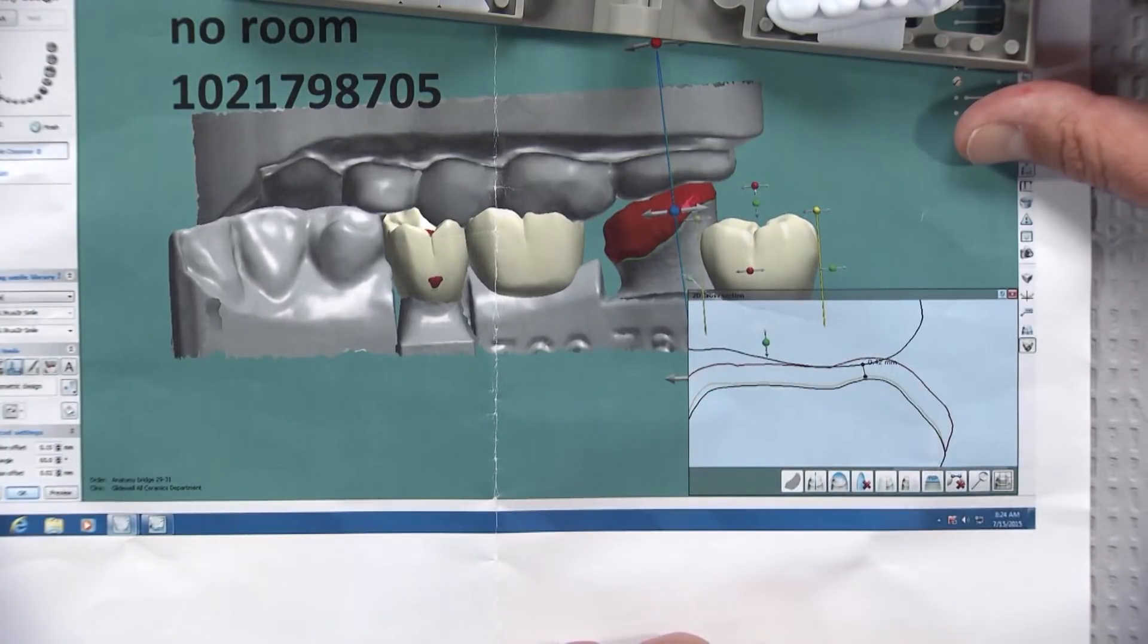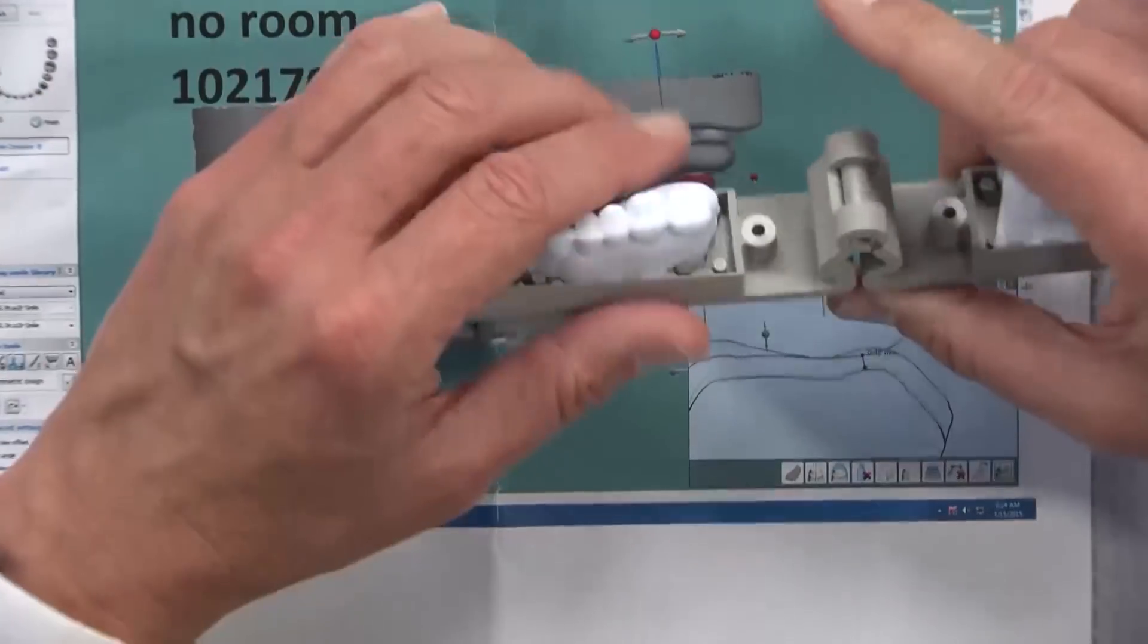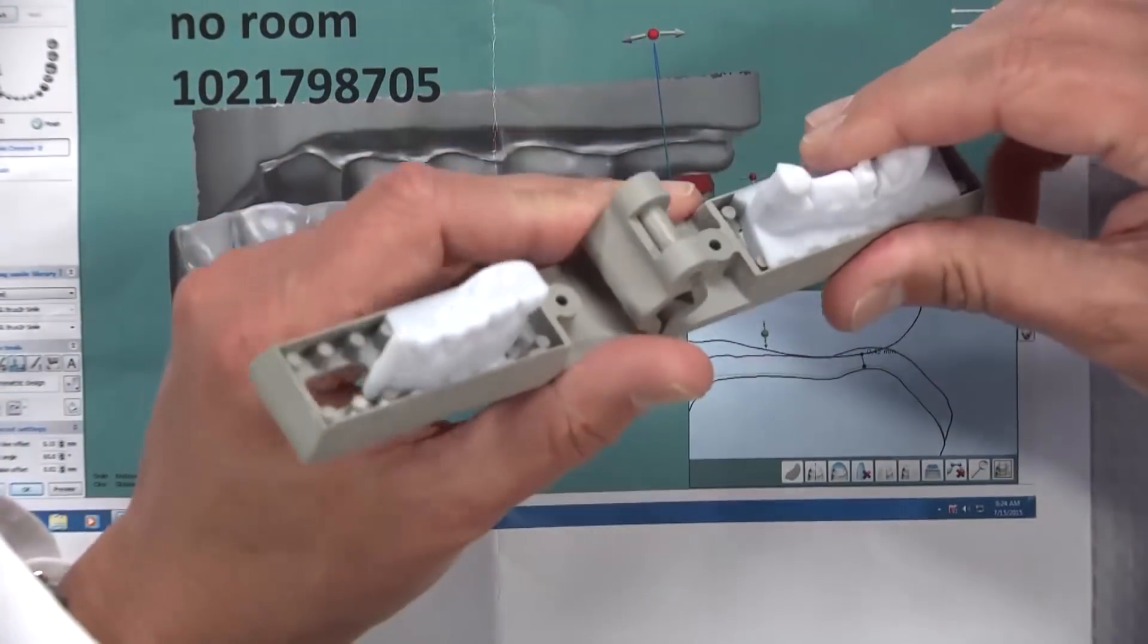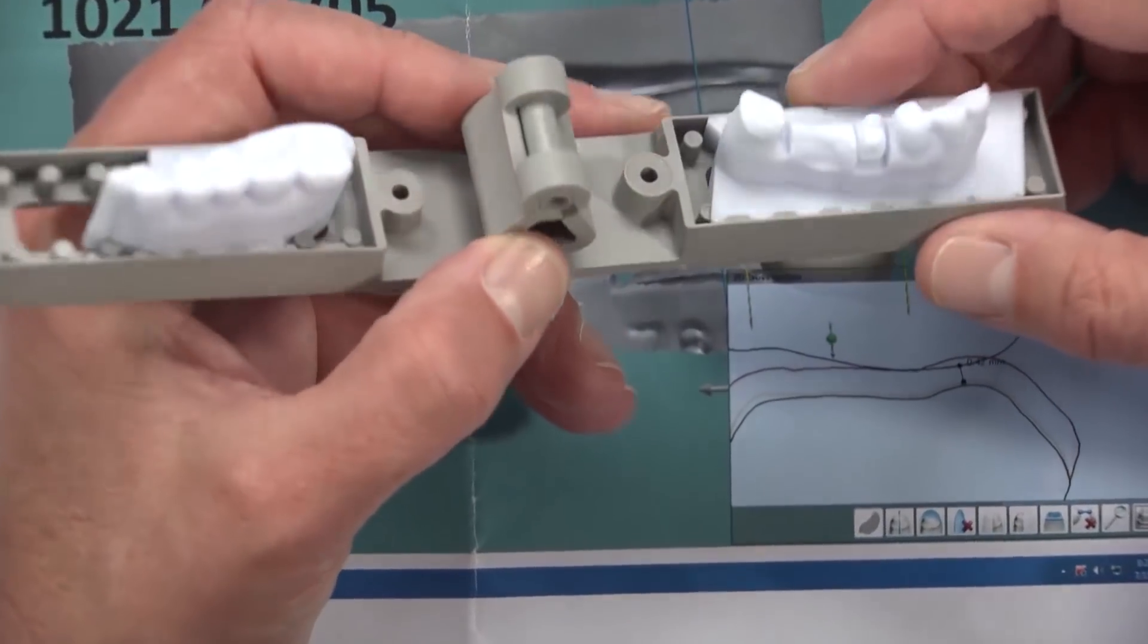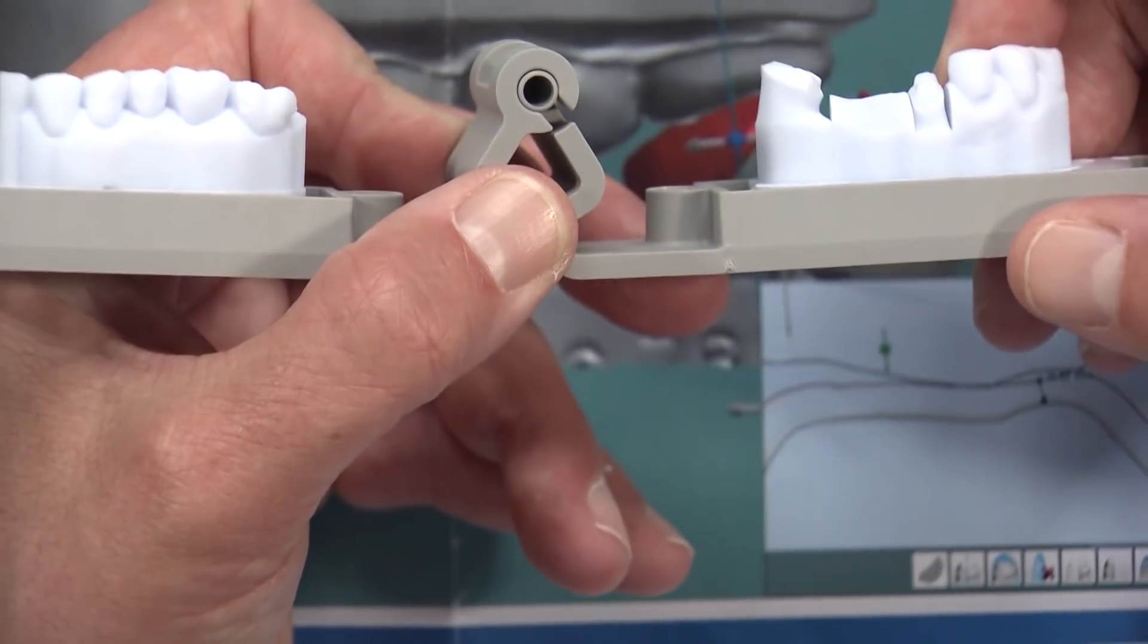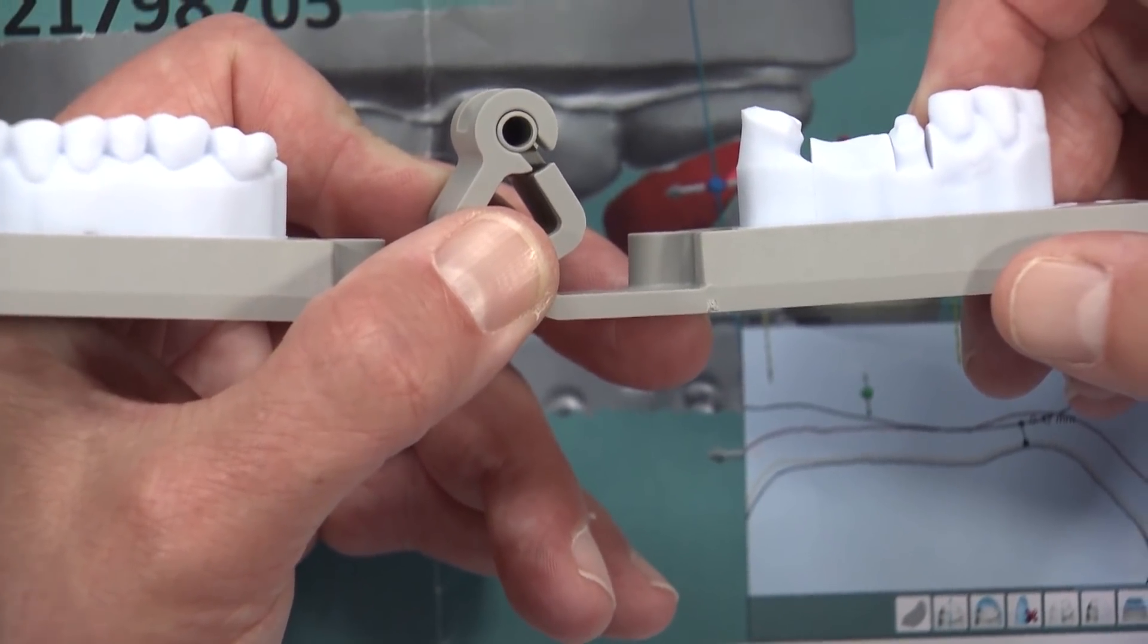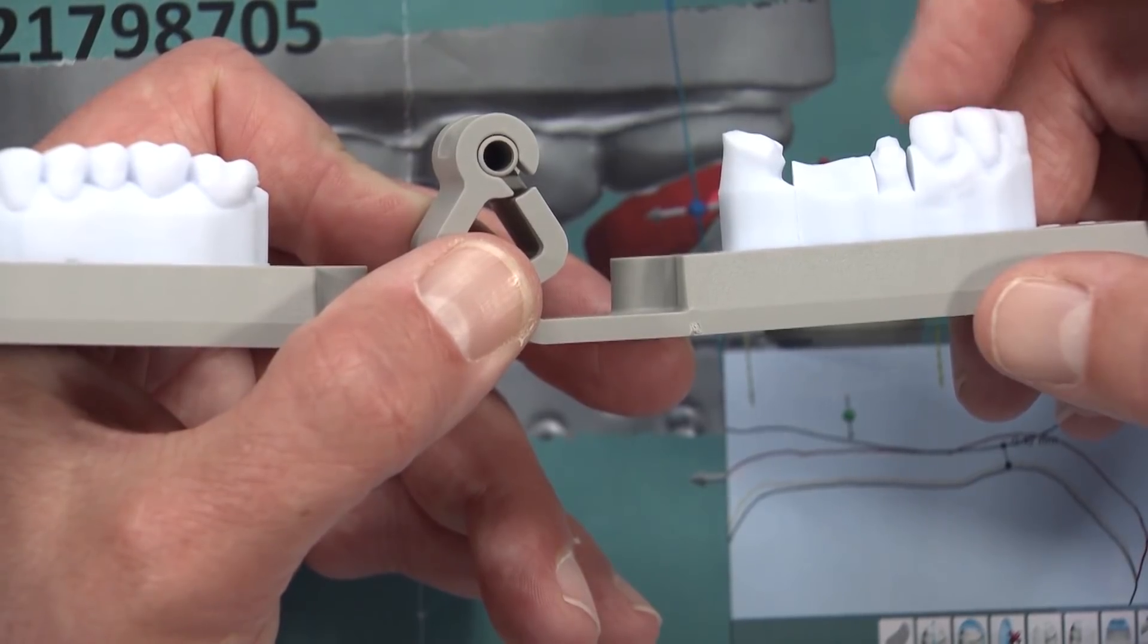At this point we don't have enough room to actually do a Bruxer bridge. If we look at the model and zoom in on this a little bit, you're going to see some issues. We have a very short distal wall. If you look at the distal, this is always very difficult to do because you can see how tapered it is.